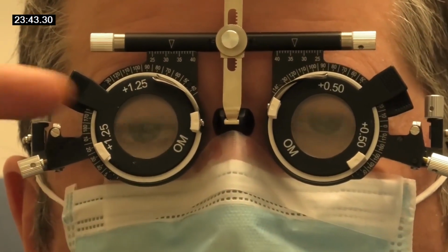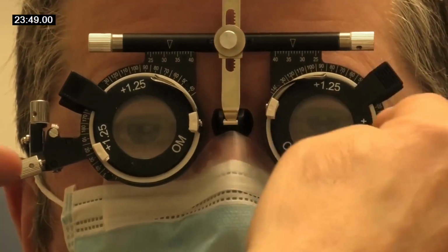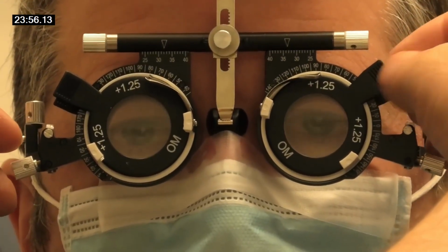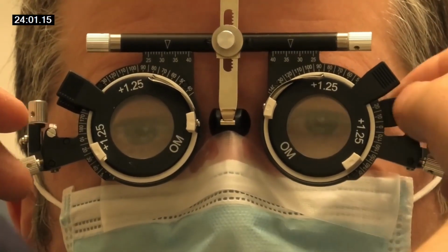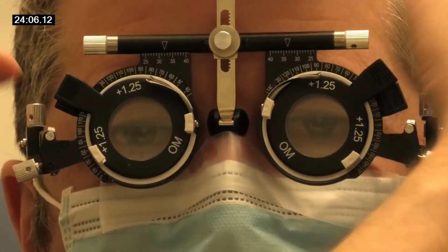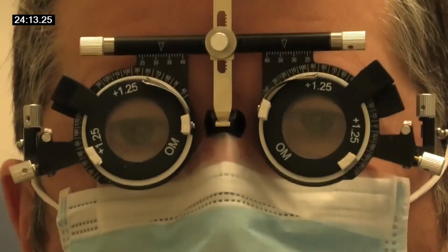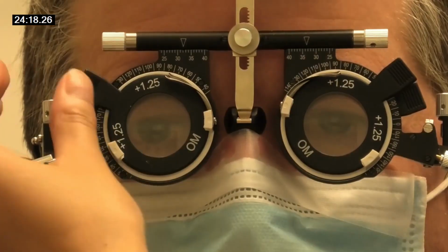The only problem about doing this is that you can get mixed up, so it's good to always put the sphere in the back, because then you know that your working lens is on the front. When it was the other way around, you could quite easily get it wrong. So it's best to always put the sphere that you've got in the back, so you don't mix it up, because you could later on come back and forget and take the wrong one out. So now it's blurred, isn't it? Yeah. And then take this one out to do the other eye.